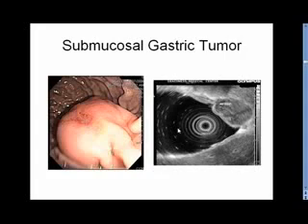On endoscopic ultrasound, here again is the transducer. This is water in the stomach, the gastric wall, and here we can see a hypoechoic mass, fairly well circumscribed, which connects here clearly to the muscularis propria. In other words, this is a fourth layer tumor which is well circumscribed and hypoechoic in the stomach, in all likelihood a gastrointestinal stromal tumor.